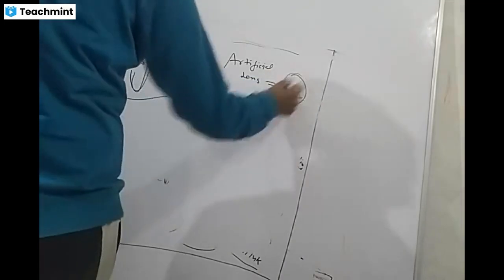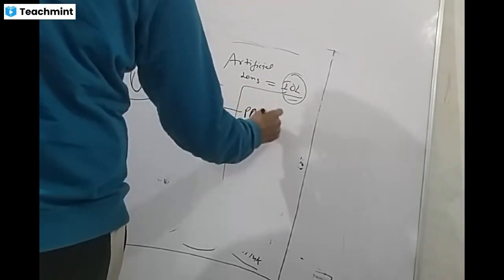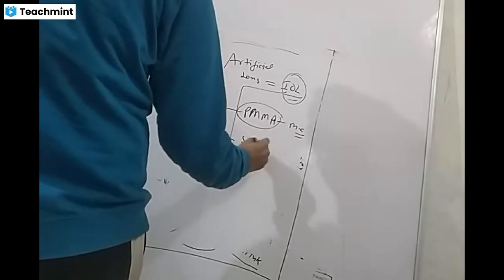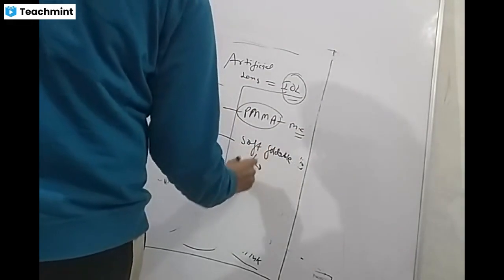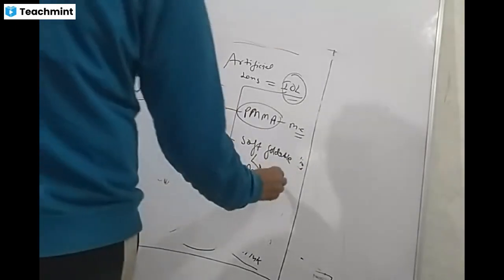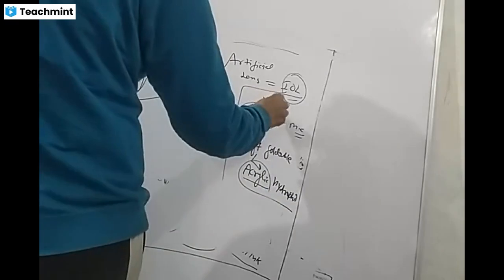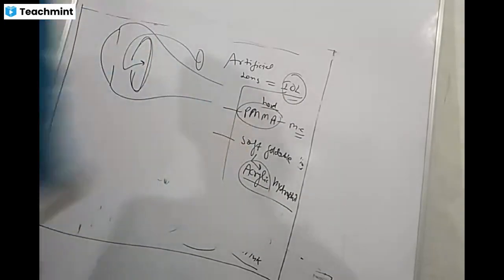These intraocular lenses are of two types. Previously, they were using PMMA, which was more commonly used. But nowadays, they are using soft, flexible, foldable lenses, which are acrylic, acrylic hydrophilic. The earlier ones were hard. You cannot fold them. So these are the lens materials that were used.